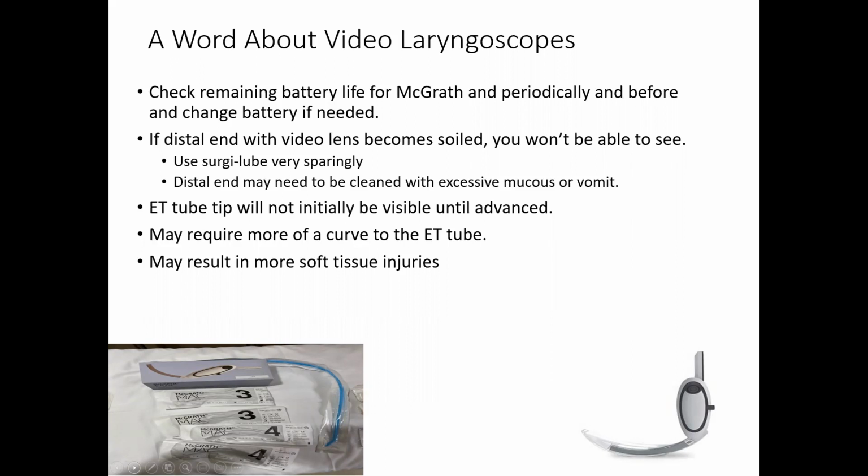We're showing you a McGrath device here in the lower right. But check the remaining battery life. The batteries last for 250 minutes with a McGrath at least. Some of them will actually even be rechargeable batteries.